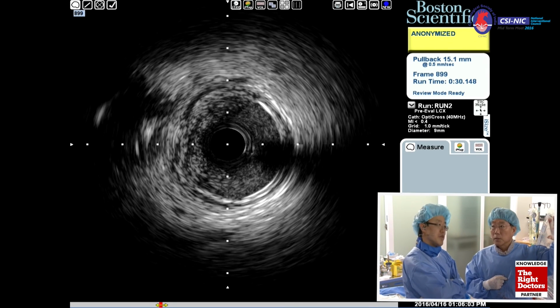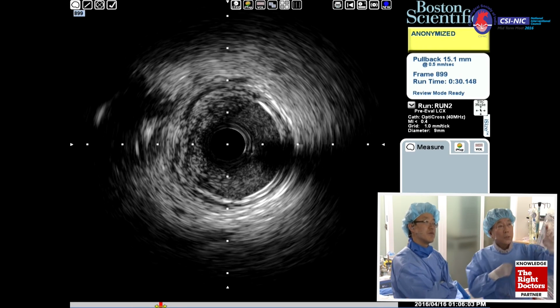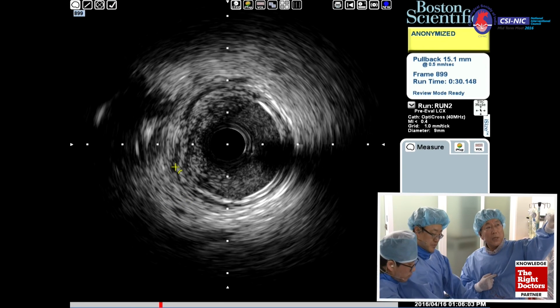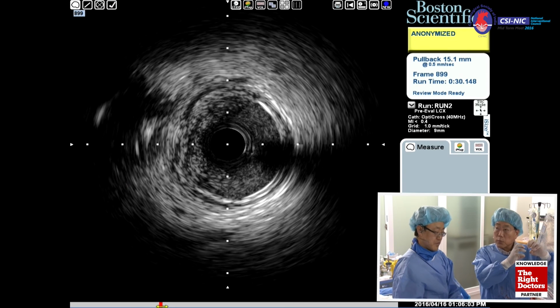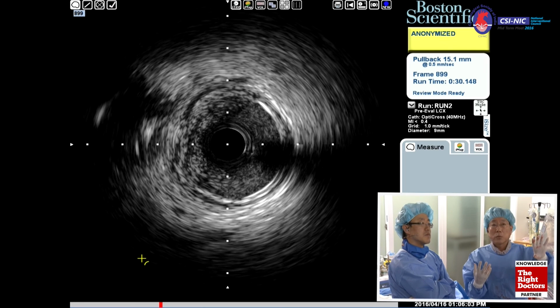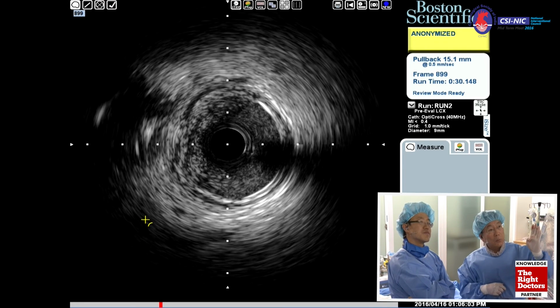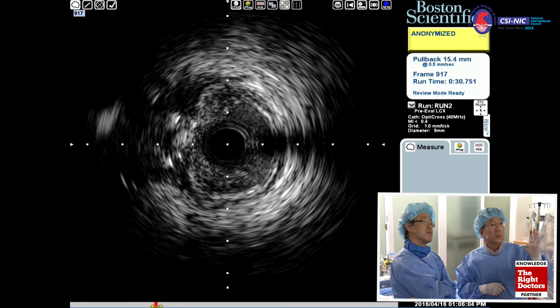2.5 to 3.0, right? Big vessel, minimal disease. However, you can clearly see at 9 o'clock, there are some wires and the LAD coming, merged with the circumflex ostial part. Those areas we named the polygon of confluence. One or two segments there.